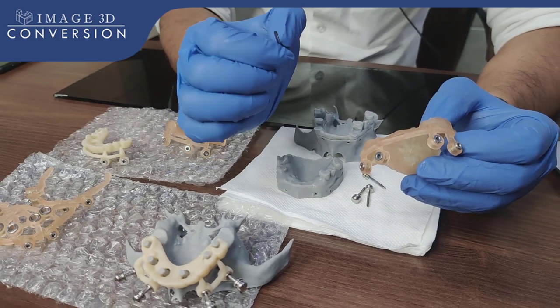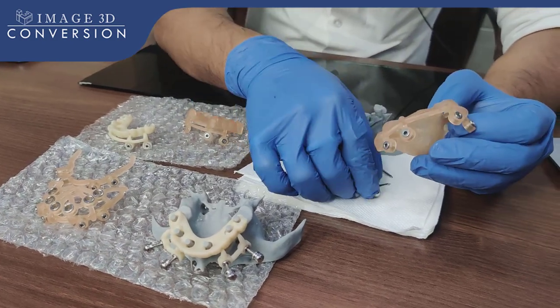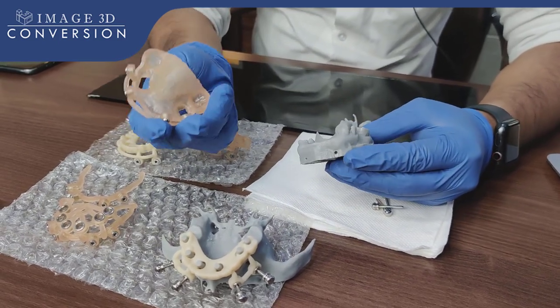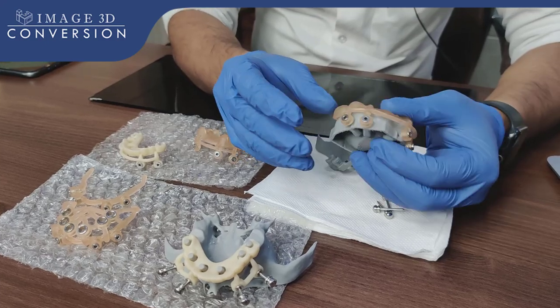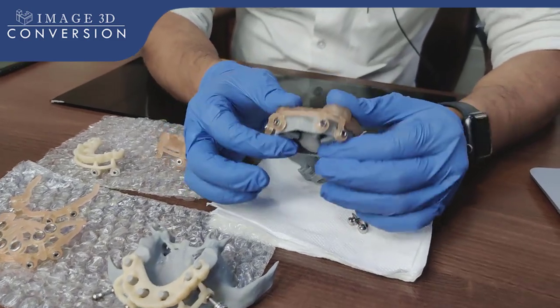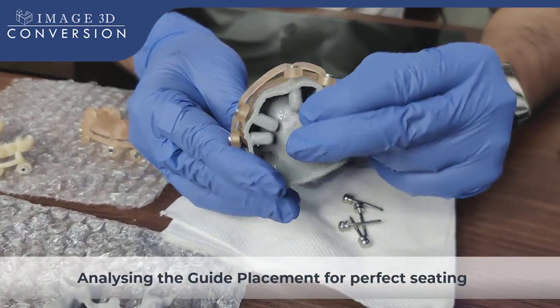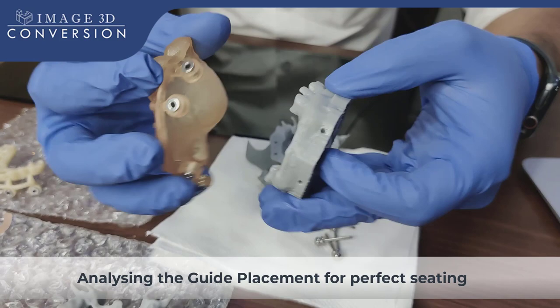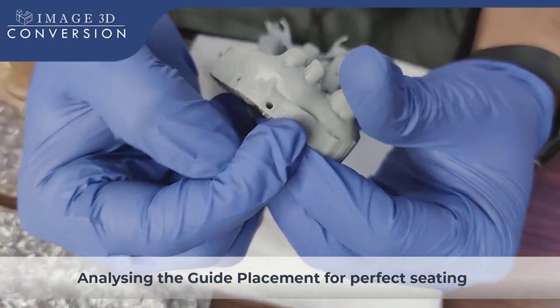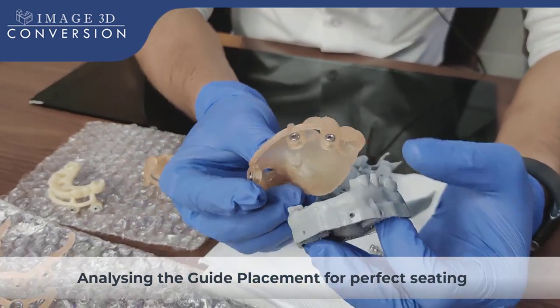This tooth-supported guide we have fabricated just to position the fixation pin. Following this fixation pin — indexing pin position — all the other guides will be indexed with the same fixation pin position. We need to verify where the fixation pin positions will be. Now you see I'm verifying — this surgical guide is not sitting properly because I am not holding this surgical guide in the patient's mouth precisely. These are the fixation pin holes we have defined.